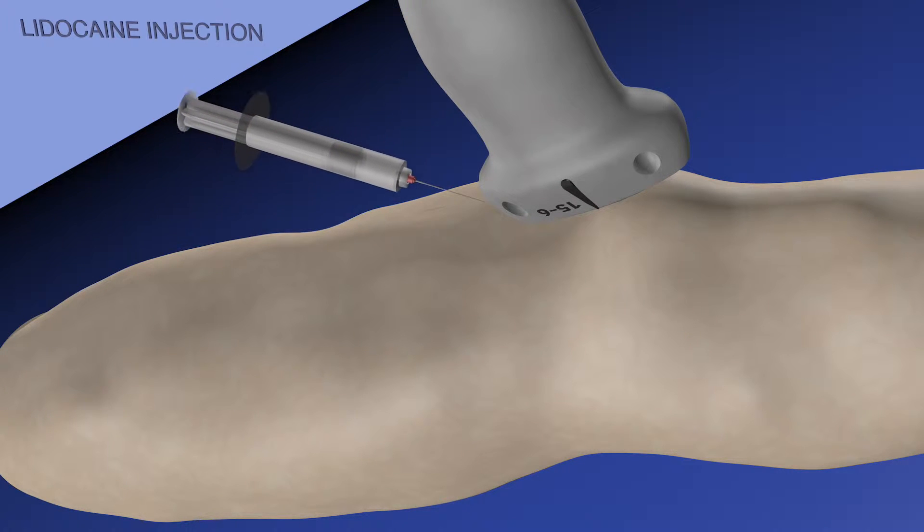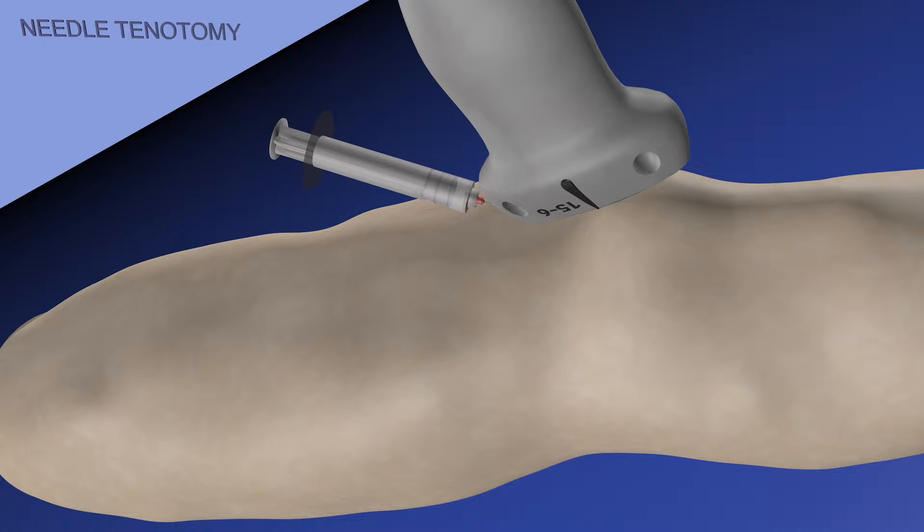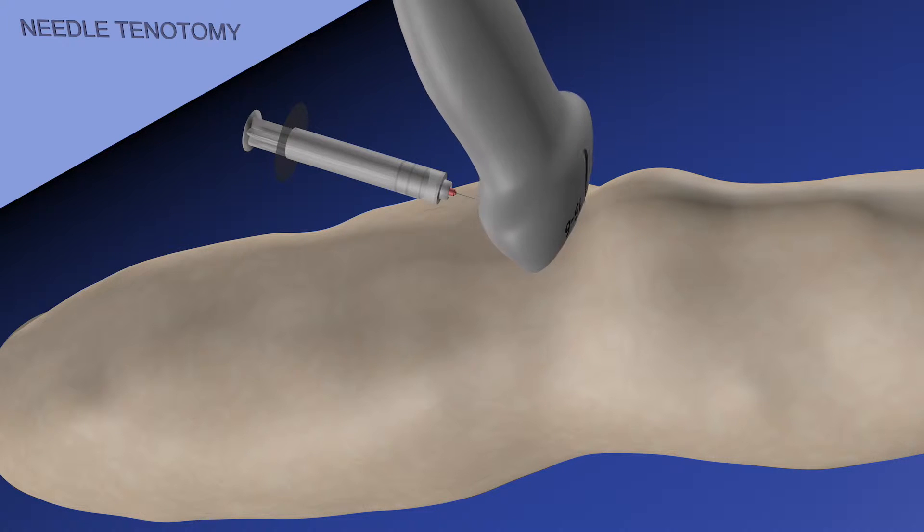Here we are rotating back to the sagittal plane, starting with a lidocaine injection. We're essentially injecting just superficial to the quad tendon, and here is the beginning of the needle tenotomy where we're trying to fenestrate the tendon and break up some of that calcification in the distal quad tendon.